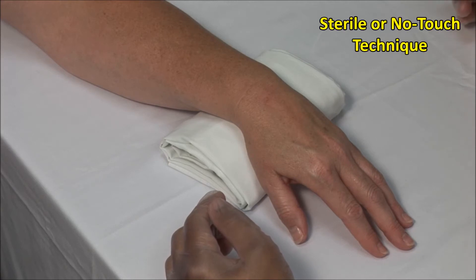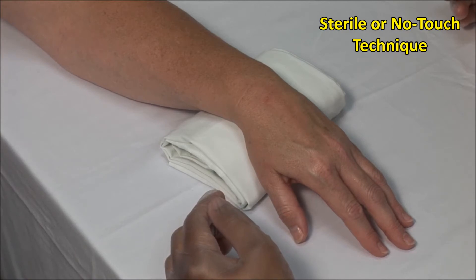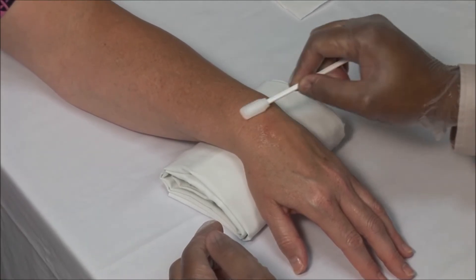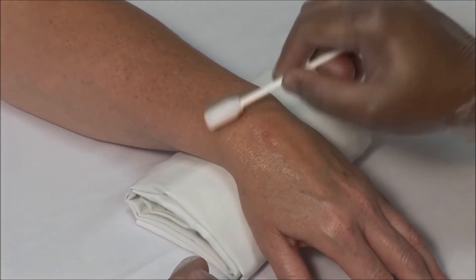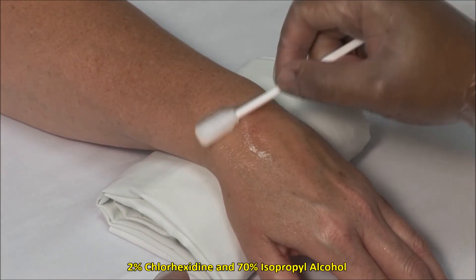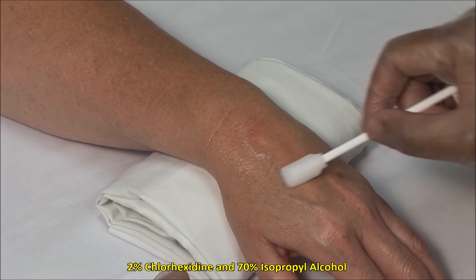These injections should always be done using sterile precautions. A no-touch technique is used, meaning that once the area is cleaned it must not be touched with anything but sterile needles. Scrub the site and then clean in an outward fashion. I am using a solution of 2% chlorhexidine and 70% isopropyl alcohol.